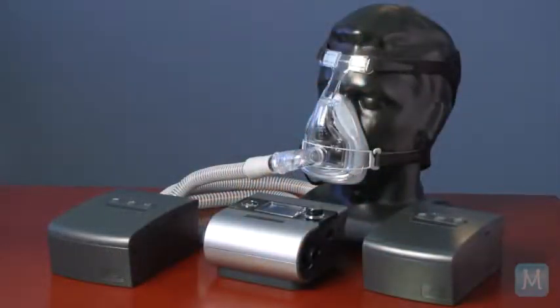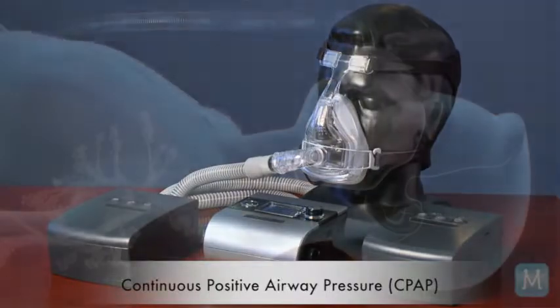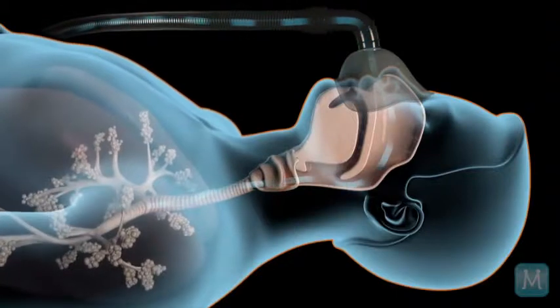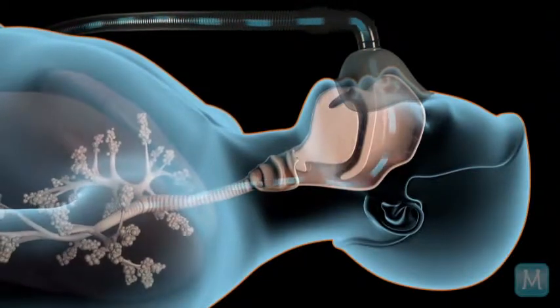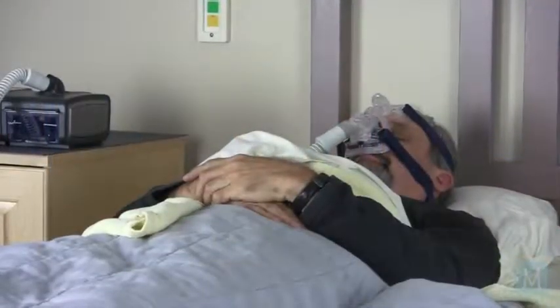So there are different kinds of positive airway pressure machines oriented towards different kinds of patients. The most common one is a continuous positive airway pressure device known as CPAP. And that provides the same pressure if someone inhales or exhales, and is really oriented towards the people with obstructive sleep apnea, and that airway simply needs to stay open. So in terms of auto CPAP, what's happening is that the patient may have different needs of pressure in different parts of the night or from day to day. And that overall positive pressure can change over the course of the night.